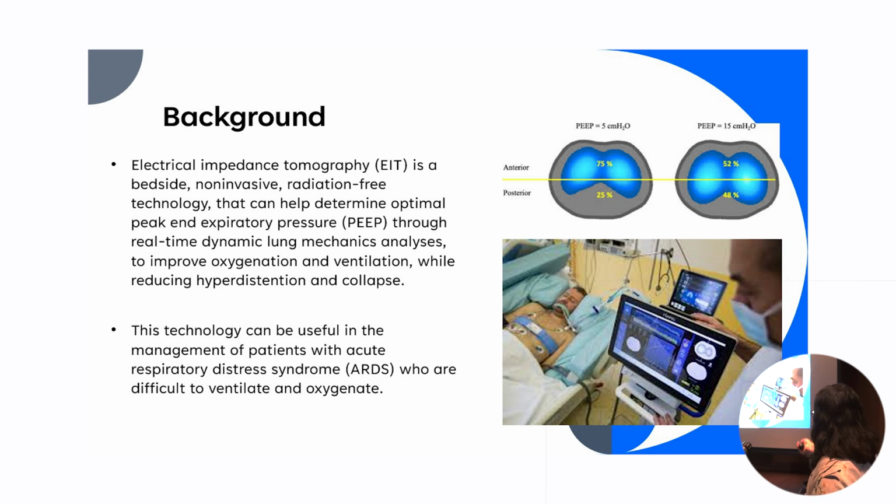Over here, this picture I included is, again, as an RT, when I walk into the room, what am I going to expect? At our facility, we use the Timpel console. They're the company that makes the console that we use. I believe that Draeger and Sentec also have consoles, but Timpel is the only FDA-approved console out there that utilizes EIT. I'll have another picture of what the console looks like in later slides, but it's not a huge platform. It's similar to having another ventilator at the bedside.